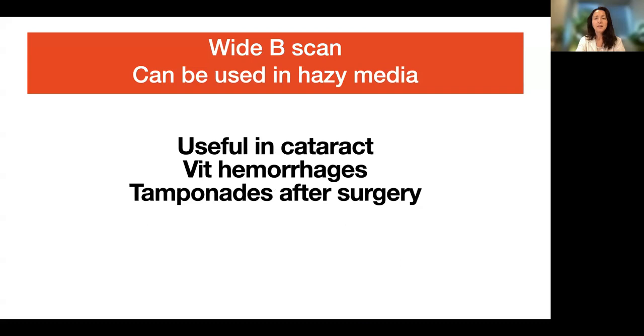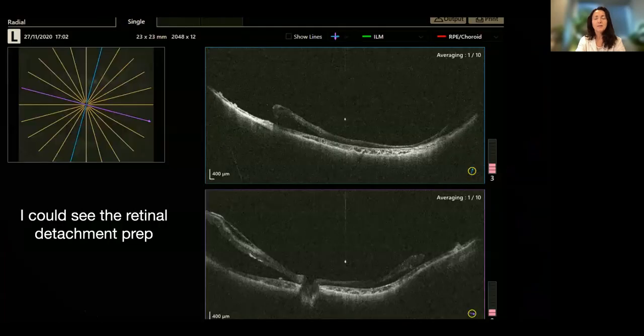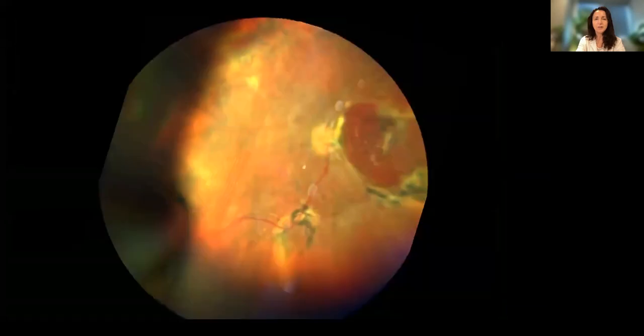In hazy media, it is very useful. We can see this young 8-year-old patient that I operated for retinal detachment after a cornea transplant. The view through the retinography and the direct view is very difficult, as you can imagine.